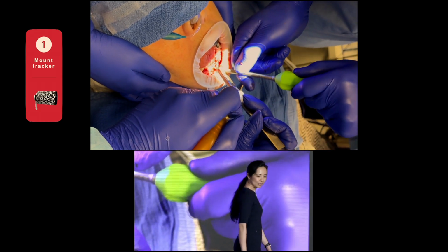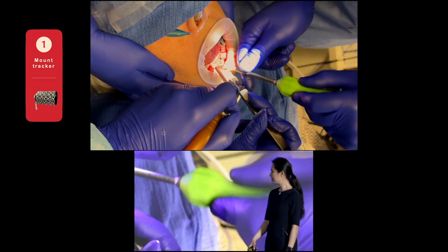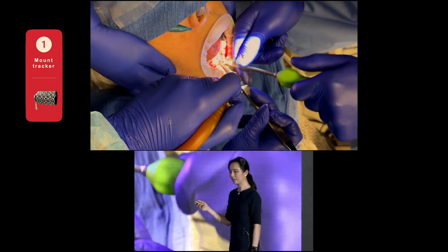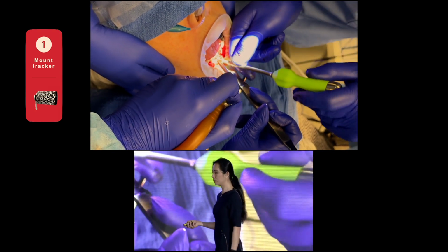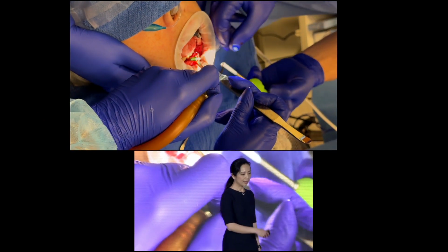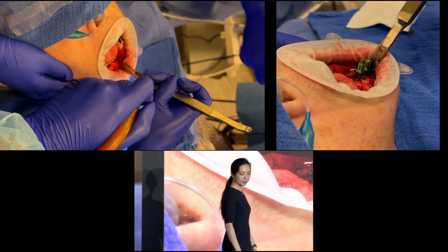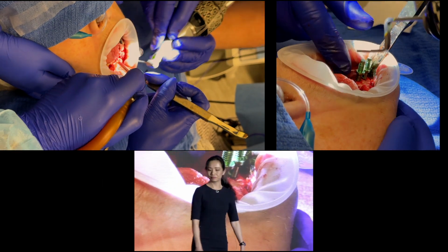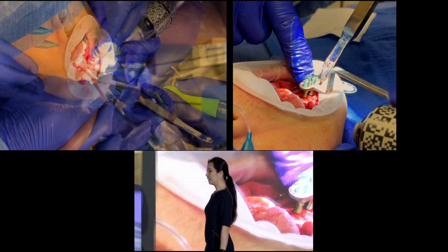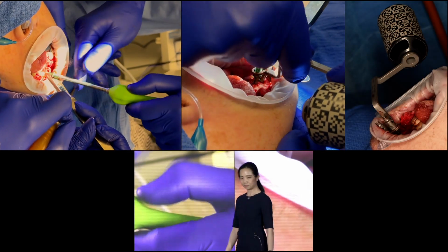And this video could have easily been about 10 minutes, but since the surgeon has been using the X-Nav for every single case he's done in the past year, this is a very fast process. So once he identified where he needed to place the anchorage pins, he goes ahead and mounts everything onto that. So there are the 2 pins in place. And part 3, that's what it looks like when everything's ready to go.